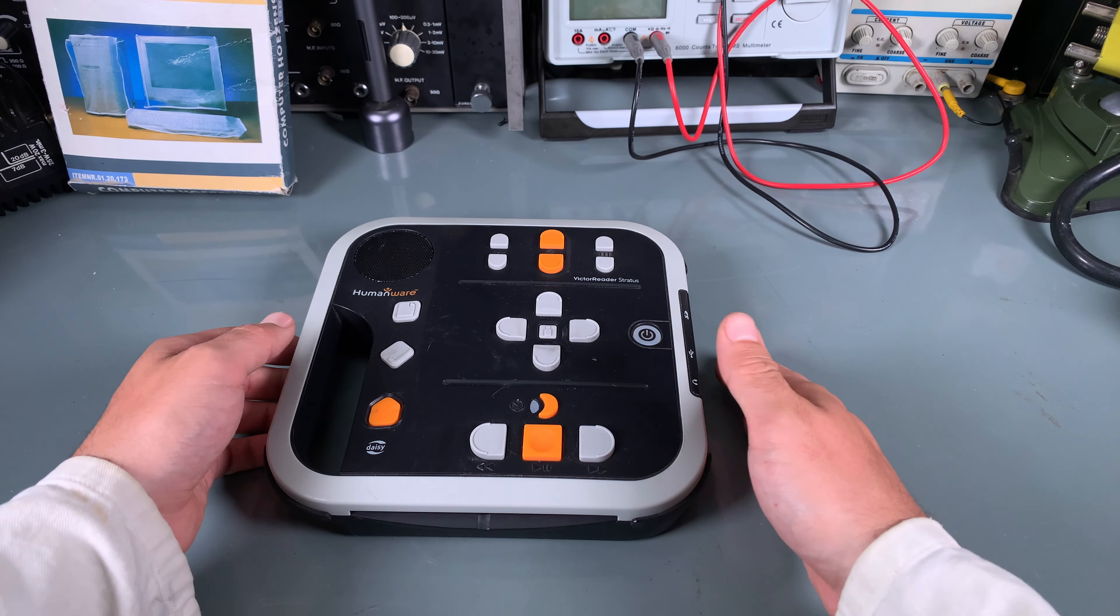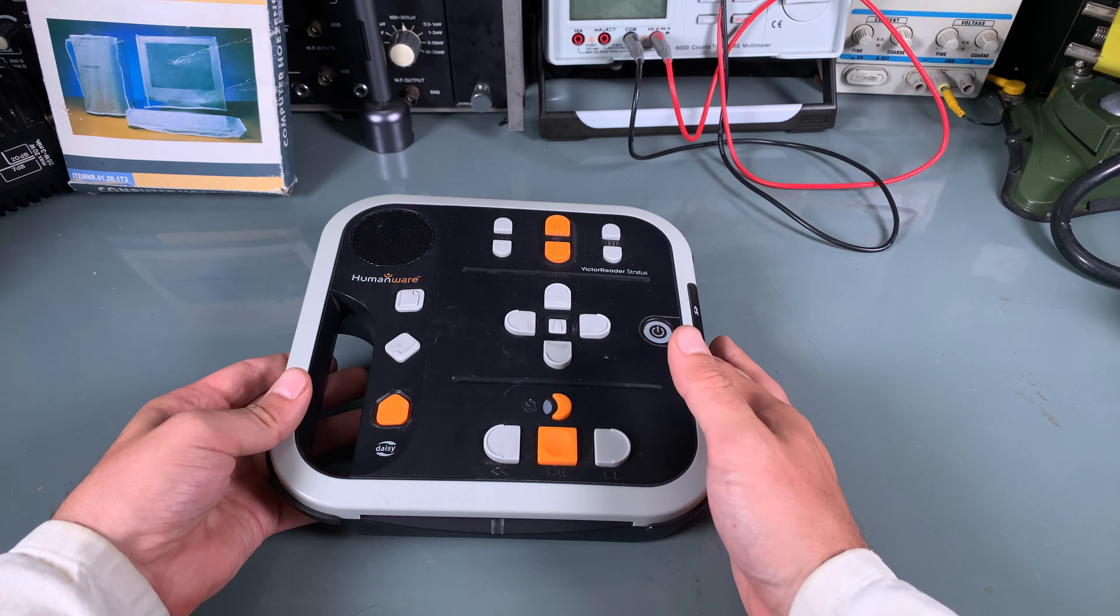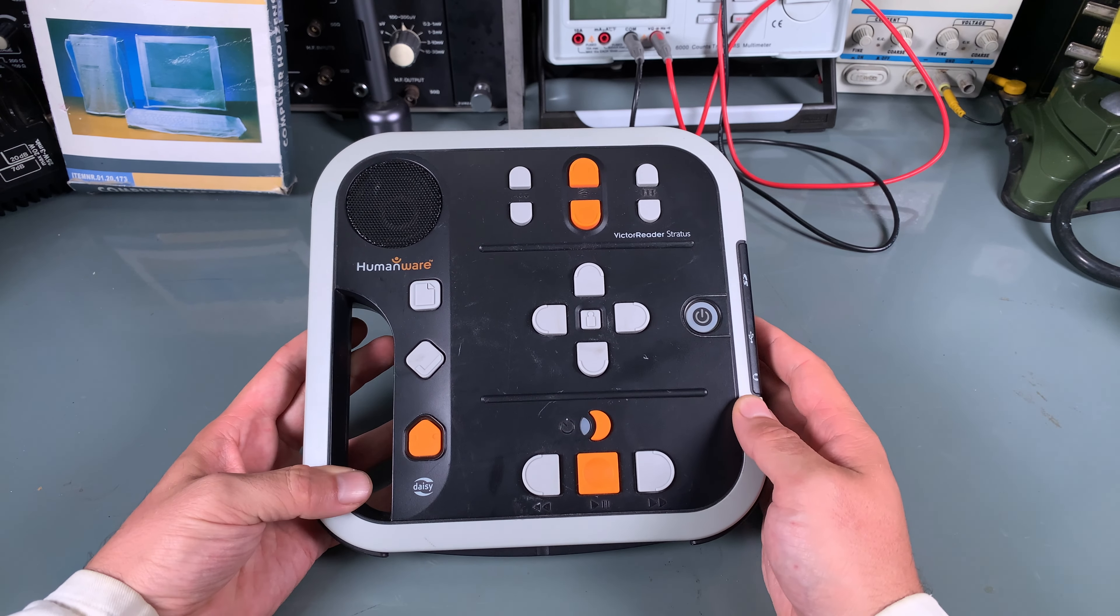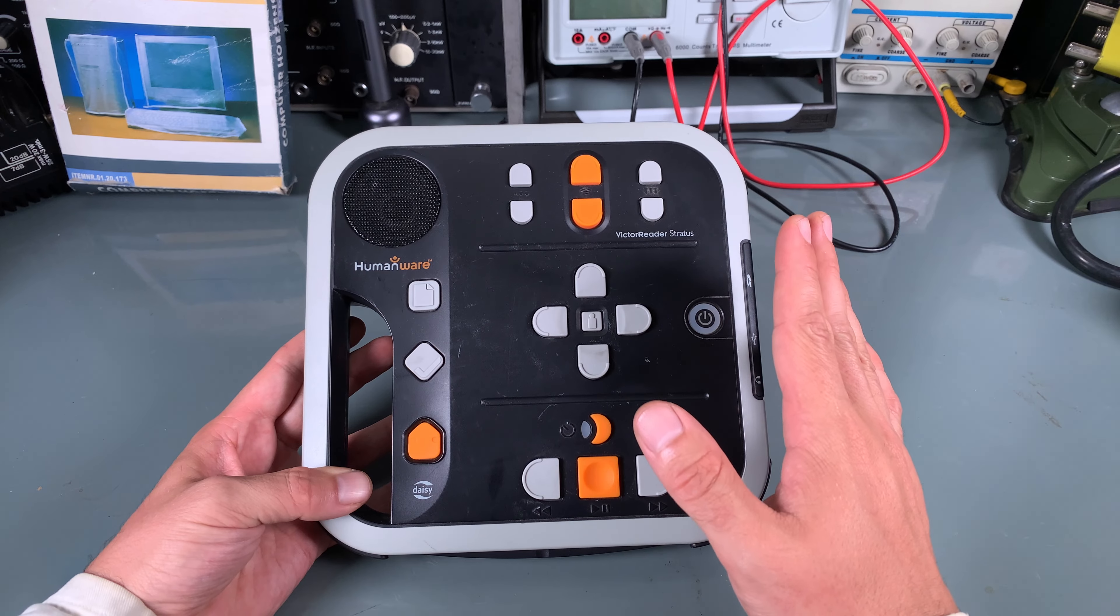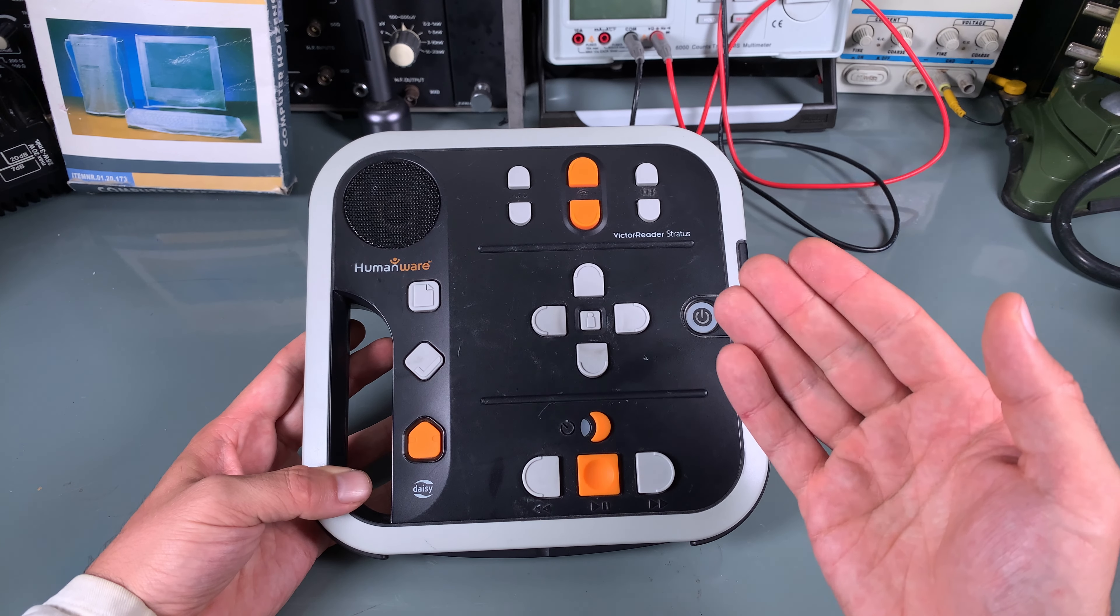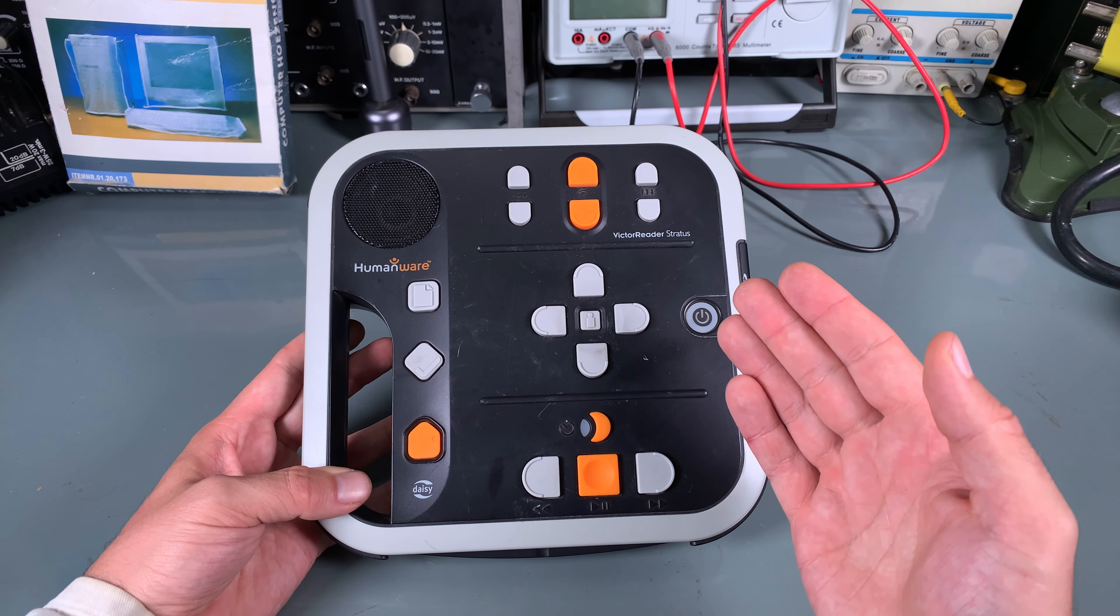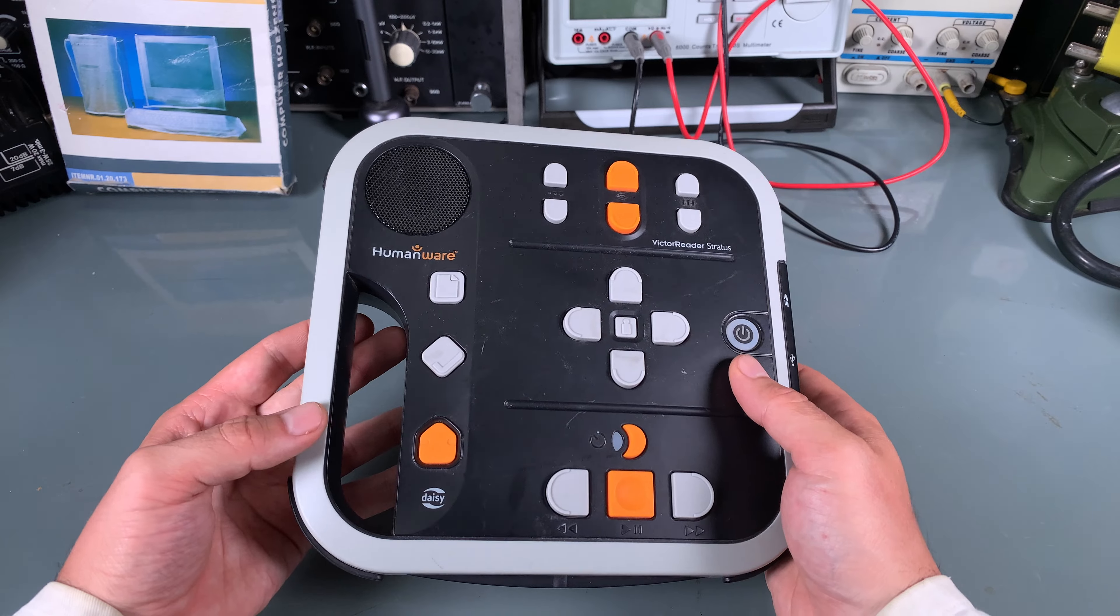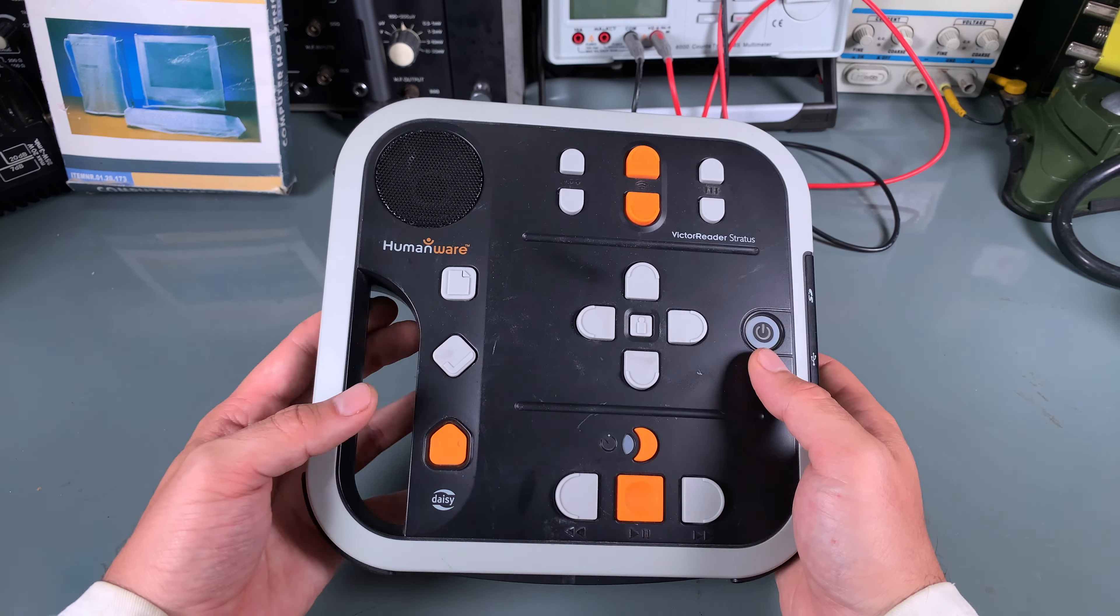Hello, today I would like to show you this interesting device that is used by people who have impaired vision or are blind.